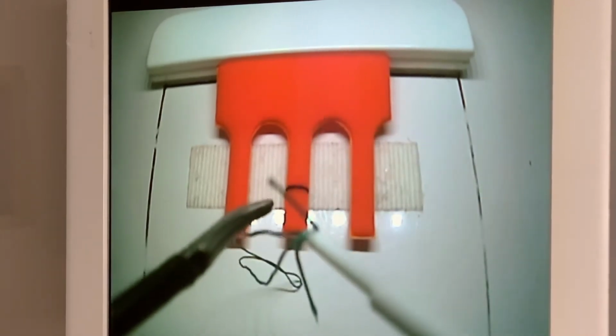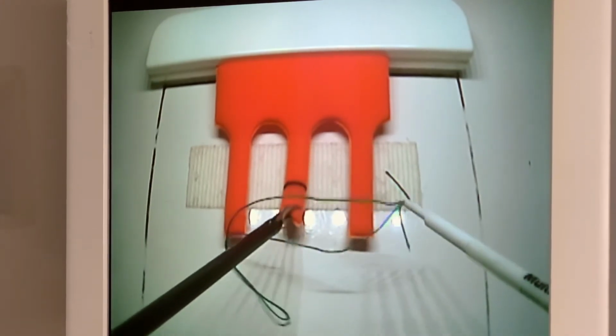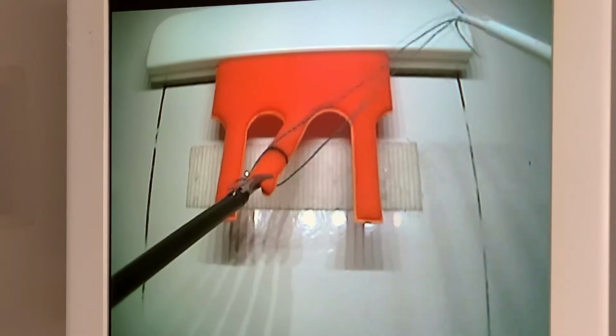Task 3, ligating loop. The goal of this task is to place the ligating loop around the pre-marked structure. You will position the loop around the mark and tighten it down, cutting the end of the loop material off.